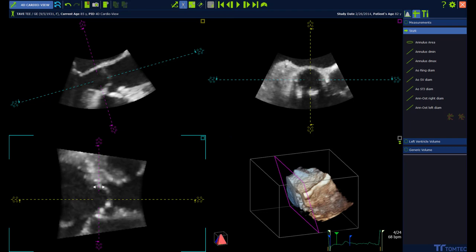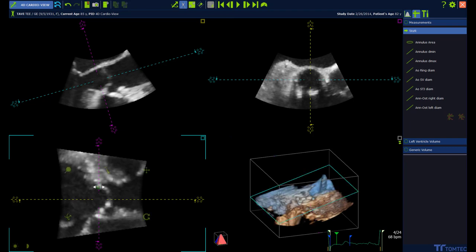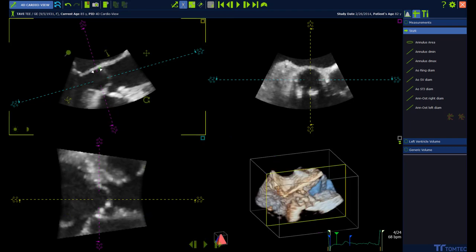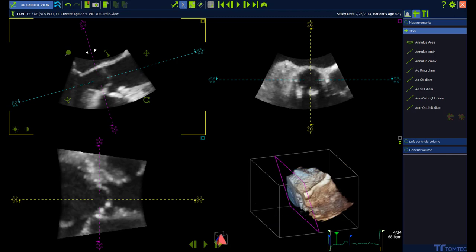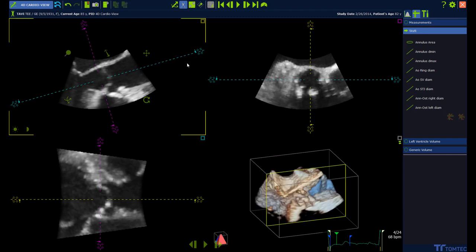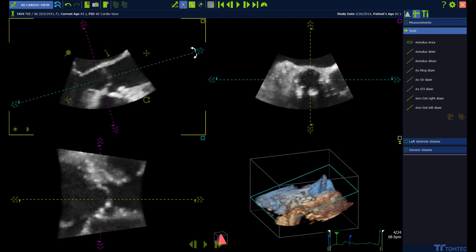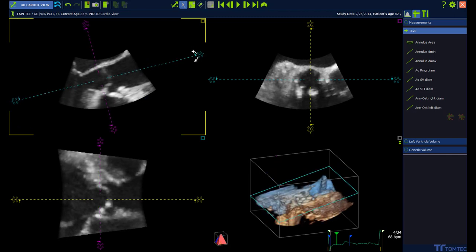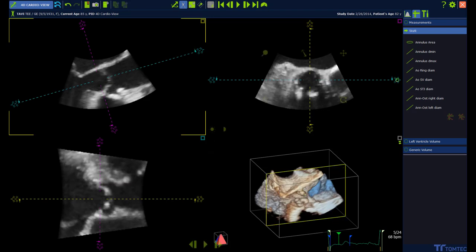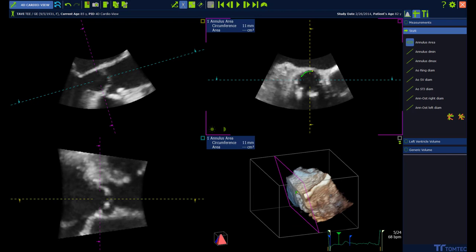Now we have the right plan to perform the first measurements. Annulus Area, Annulus Minimum Diameter, and Annulus Maximum Diameter are measured in the short axis view. Left mouse click on the first measurement, then start drawing the contour using the left mouse button to click around.